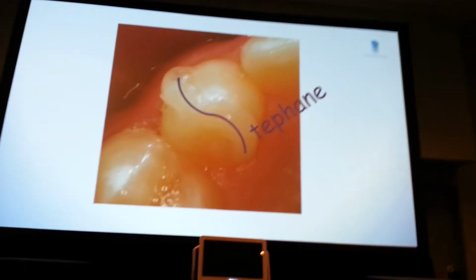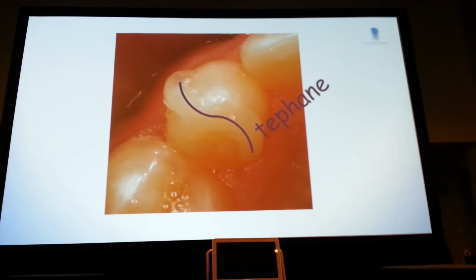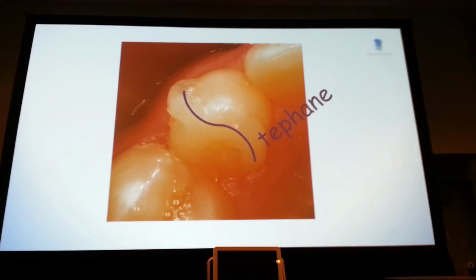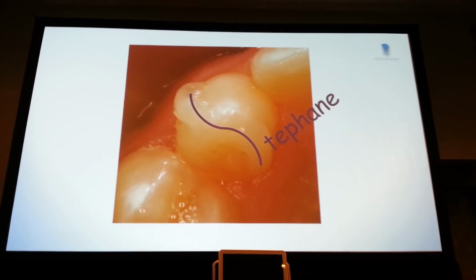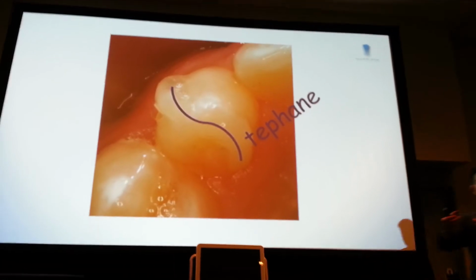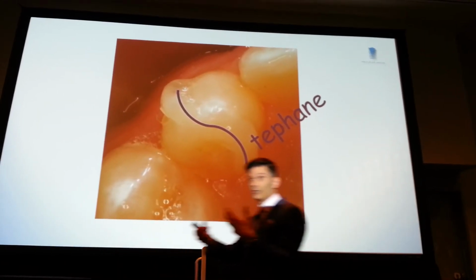Buccal and lingual attachments. Same thing with extrusion. I was saying on a premolar, you could have a rectangular attachment towards the incisor, towards the occlusal. You could do the same thing on the lingual, if you can. Again, if the occlusion gives you permission to do it.